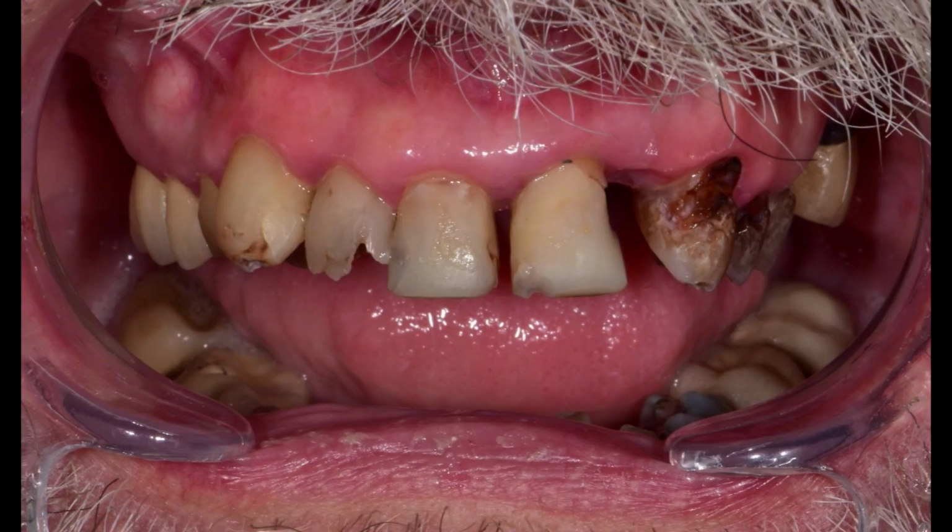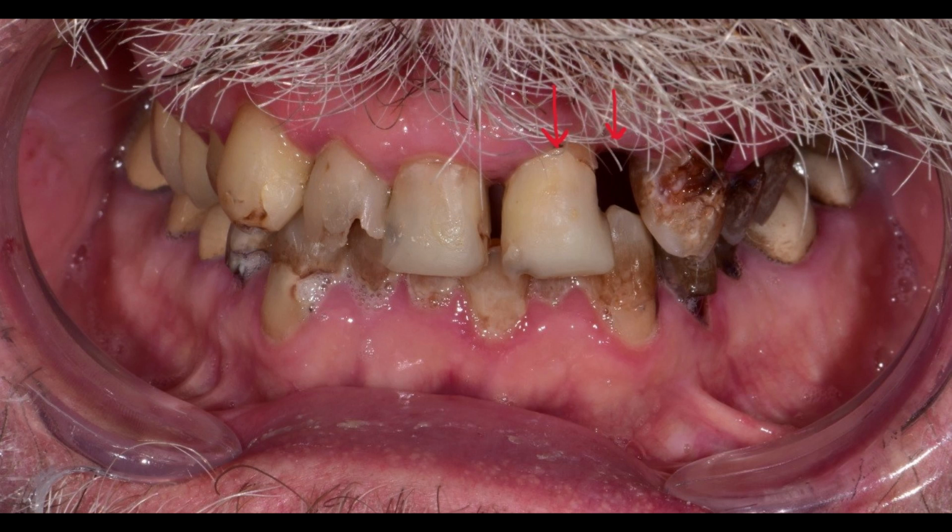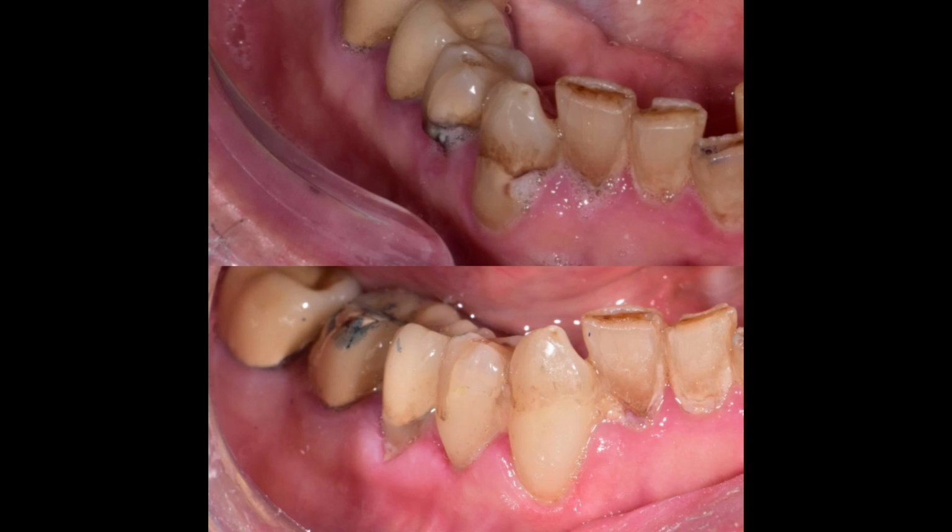We were working with a bit of a budget, and he was opposed to root canal, so our plan was to extract the infected tooth and the retained root, make a bridge from the canine to the central incisor to replace those teeth, put crowns on his other anteriors with recurrent decay, and then restore the class 5 decay with direct restorations. Here's some photos of before and after the quad 4.